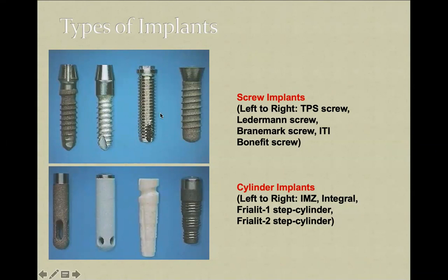Usually the diameter and the length are calculated in millimeters, and usually we have implants whose length starts from 6 millimeters up to 16. In very rare cases, with very specific manufacturers, we might have normal dental implants with a length of 18, 20, 22.